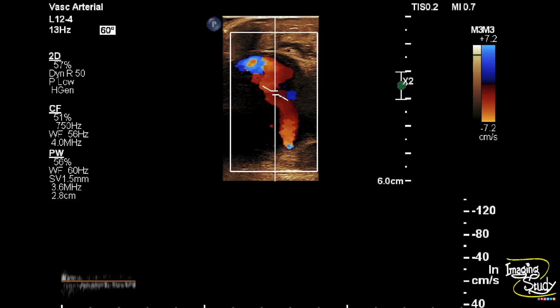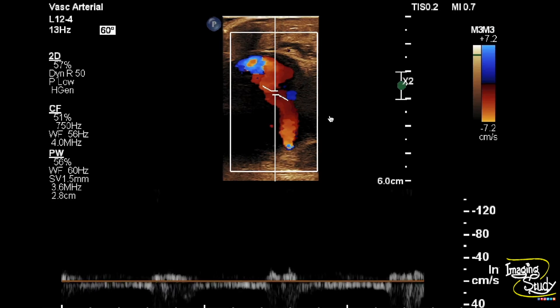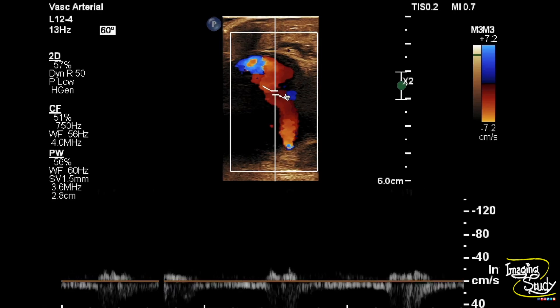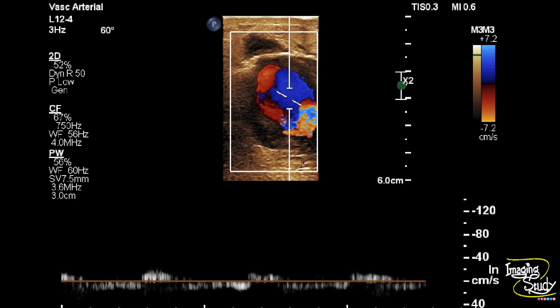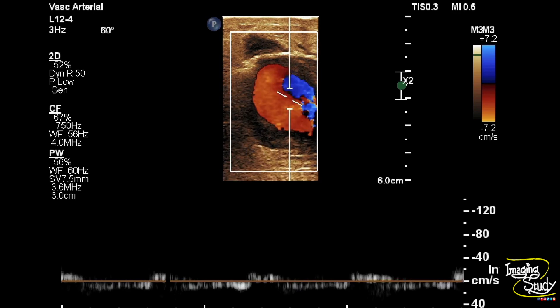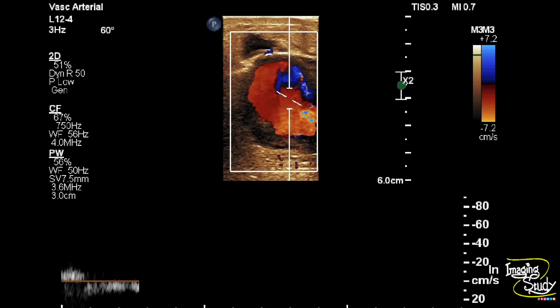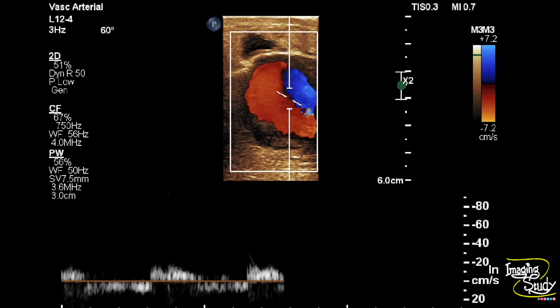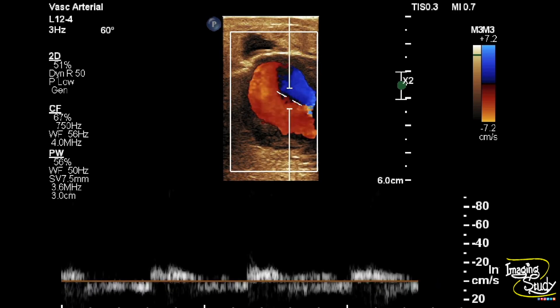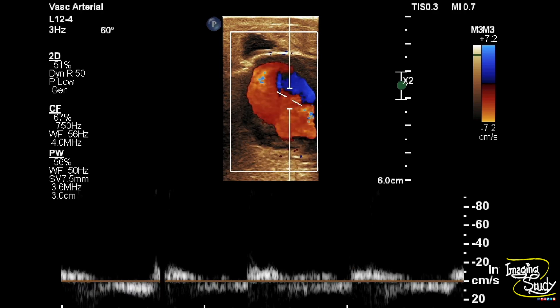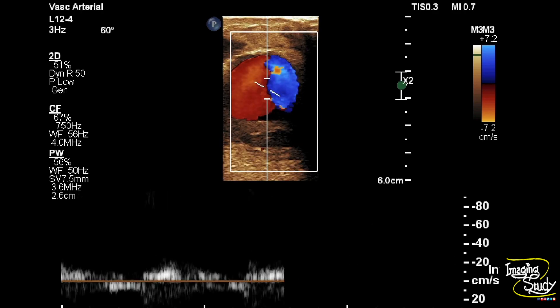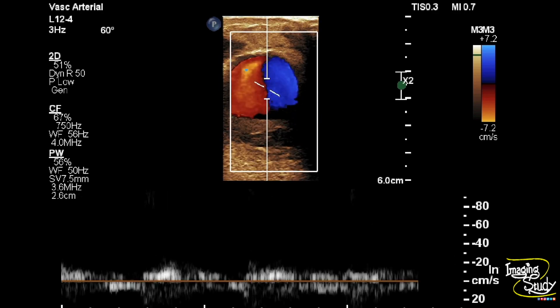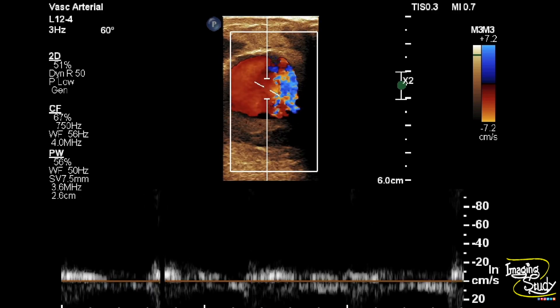Now on pulse Doppler, you can see we have taken a sample from the central part of the aneurysm at the junction between the blue and red color, and you can see a to-and-fro flow on spectral Doppler. This is the bidirectional flow because the flow has a turbulent pattern here.